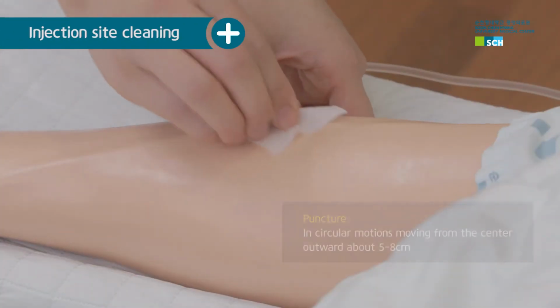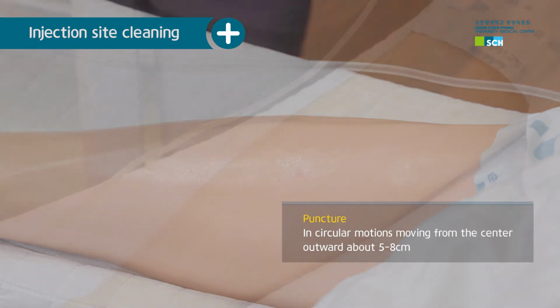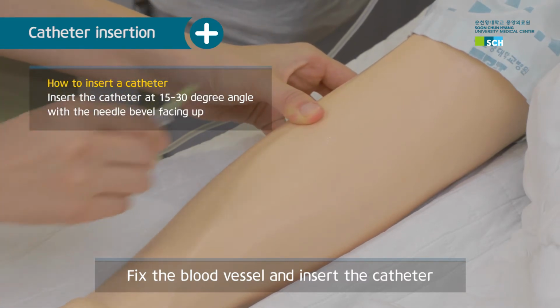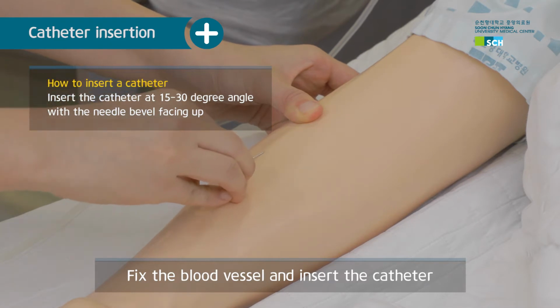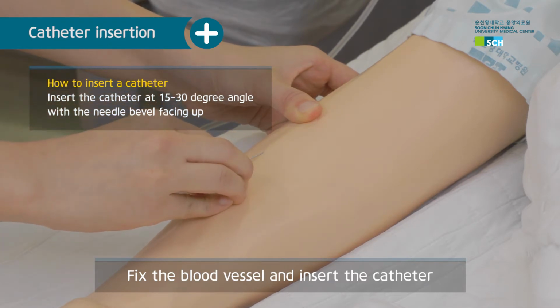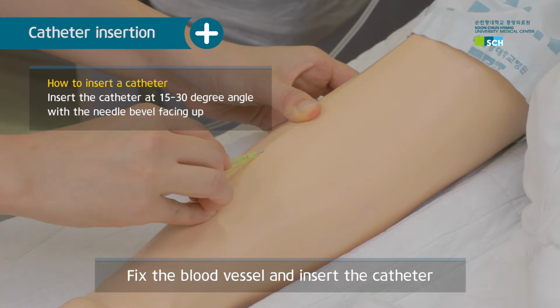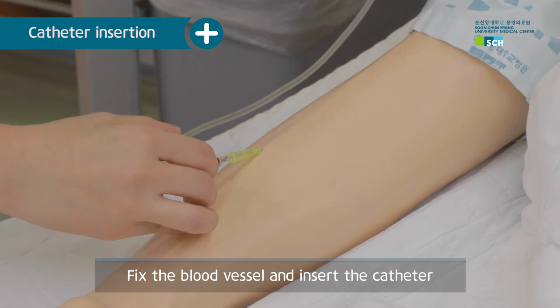Clean the puncture site with alcohol swabs using circular motions moving from the center outward. Fix the blood vessel by holding the part that is 2 to 3 centimeters away from the skin above or below the injection site with your thumb. Next, hold the catheter with the needle bevel facing up with the other hand and insert the catheter at 15 to 30 degree angle with the vein along the blood flow.